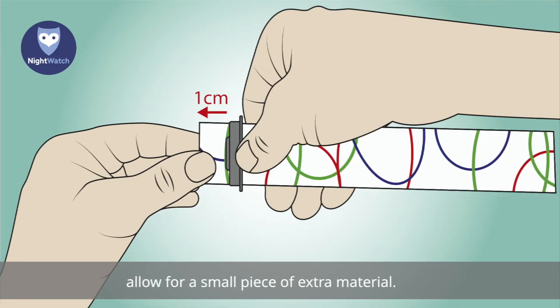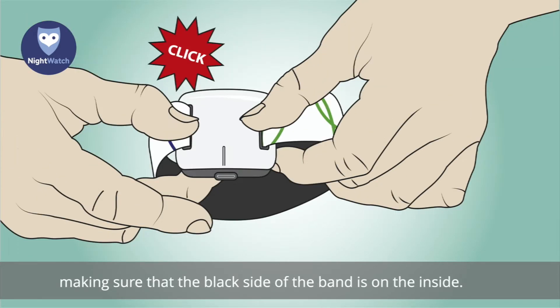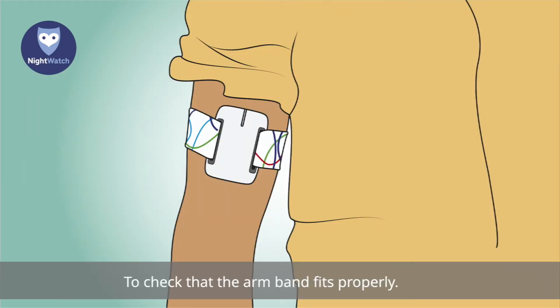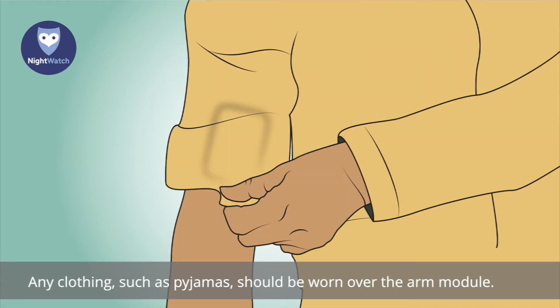Make sure the protruding part of the clip faces upwards and push the band through both clips, allowing for a small piece of extra material. Then snap the clips onto the white side of the arm module, making sure that the black side of the band is on the inside. Any clothing, such as pyjamas, should be worn over the arm module.